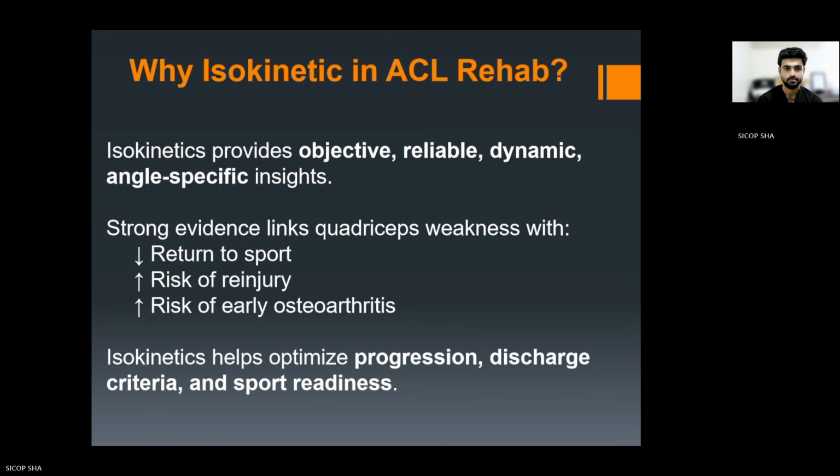Now the question is, why is isokinetic very important after ACL rehab? Now, the isokinetic machine provides objective, reliable, dynamic, and angle-specific insights. This machine gives objective and real-time data of your muscle strength. We can test affected leg versus unaffected leg objectively, reliably, with real-time data.